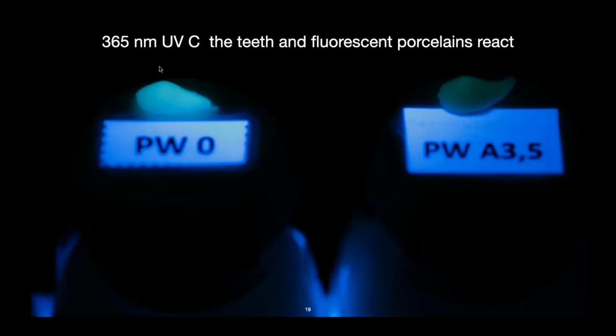And so VITA sent me some powders called Power Wash, and I saw no reaction. And I told Jim, hey, this stuff doesn't work. And then I got the other light, and wow, you see the difference? Because that's what the materials that they put in there to produce a fluorescence do.